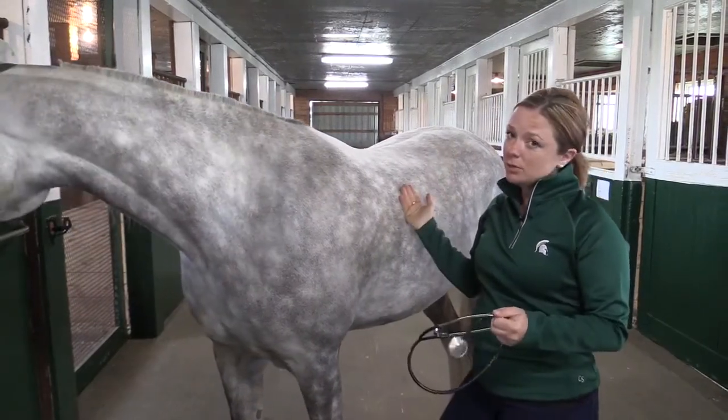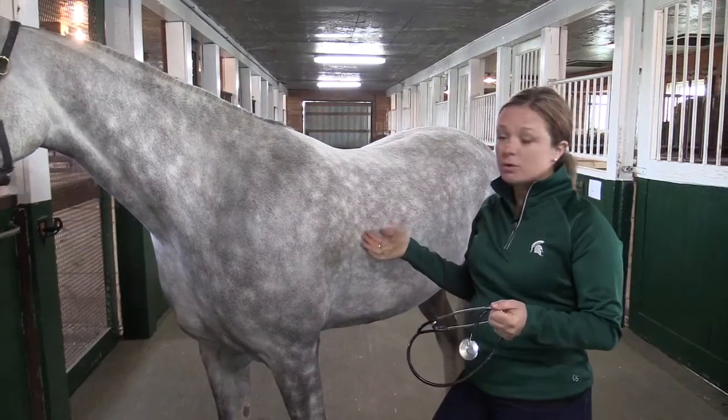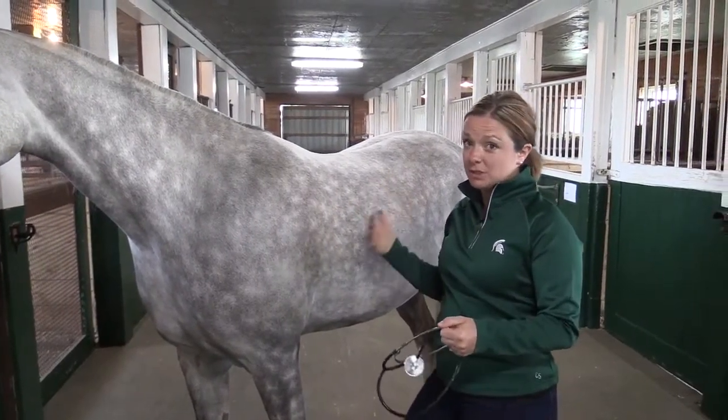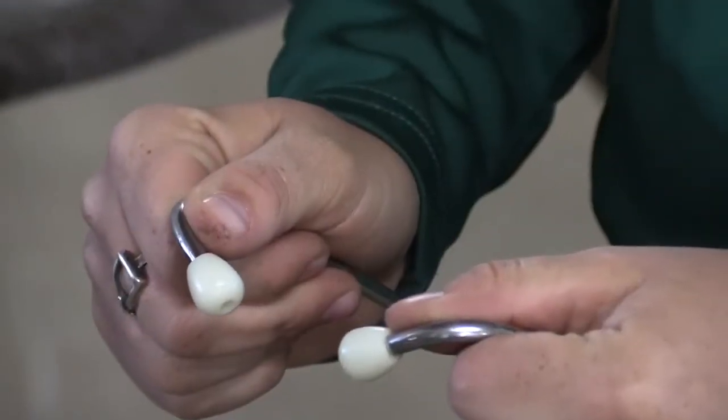My favorite way to do it is using a stethoscope. You can try to palpate and feel the horse's pulse with a couple different arteries, but I haven't had much success personally doing that. I always have success using a good old stethoscope.